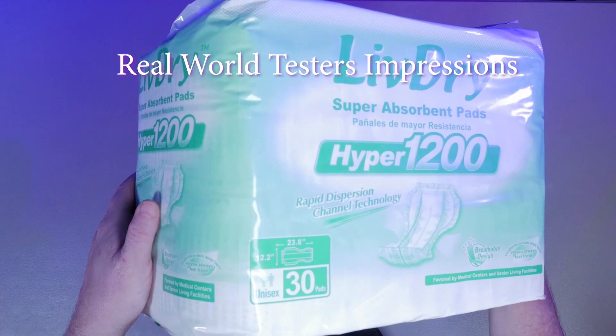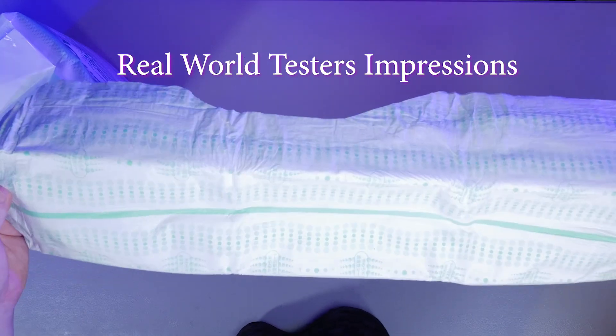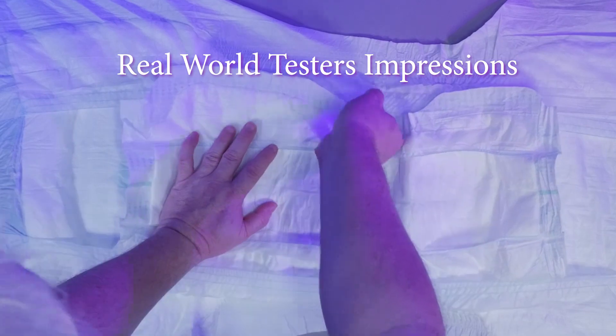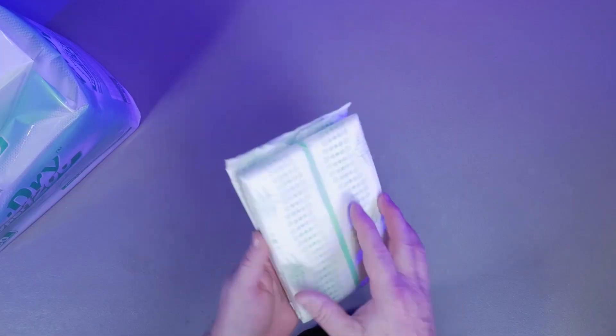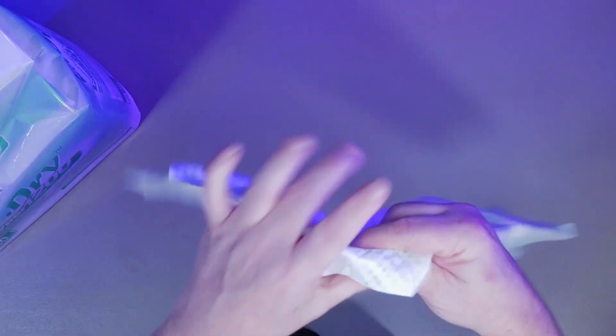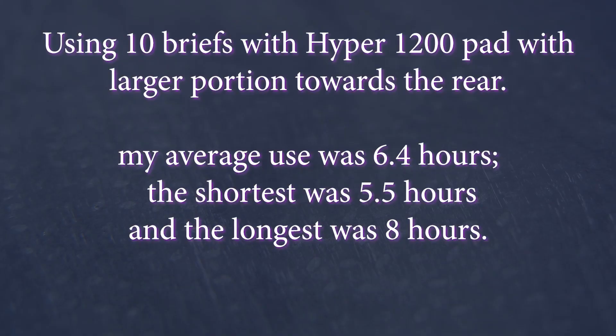For the next step in the review, I used 20 of the Hyper 1200 boosters, both with the larger section worn to the front and back, 10 of each. The pad is relatively large, thick, and very soft. It also has its own built-in standing leak guards and waterproof backing. There is no adhesive strip to keep these pads in place. As designed, the combined system performance was notably better than using the premium brief alone. However, I quickly found the pad moved and shifted around during use and activity, and I had to readjust the absorbent pad into usable positions to maintain best absorbency. Using the Hyper 1200 pad with the larger portion towards the rear, the average use was 6.4 hours. 5.5 hours was the shortest amount of time before needing to change, and 8 hours was the longest.